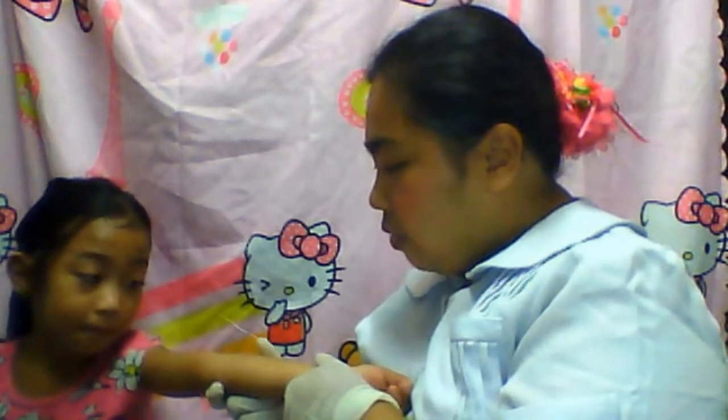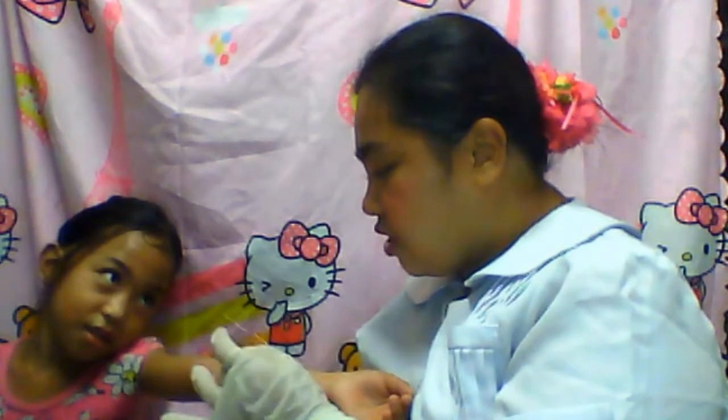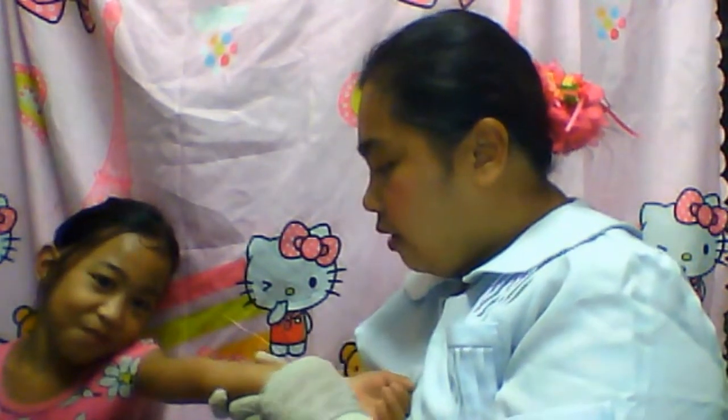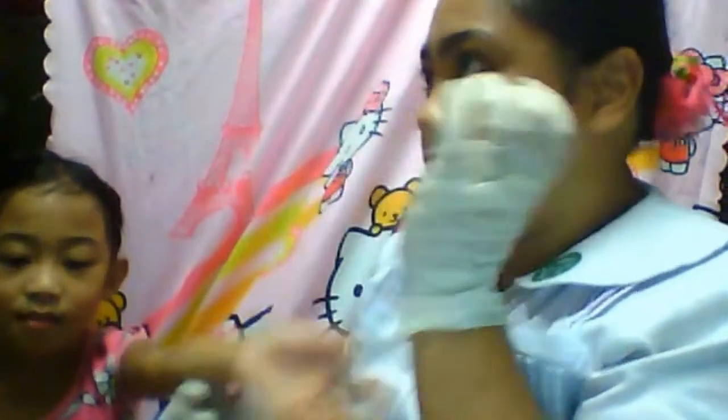So first is I will be giving the intradermal, which is, for example, for our skin testing. So again, the best site is actually the inner aspect or the inner forearm of the patient, this one. So what we do is we look for the best site, the one that has no lesions, moles, veins, redness, rashes, nothing. So this site should be smooth and clear. You do not want those things to hinder or to give us inaccurate results.